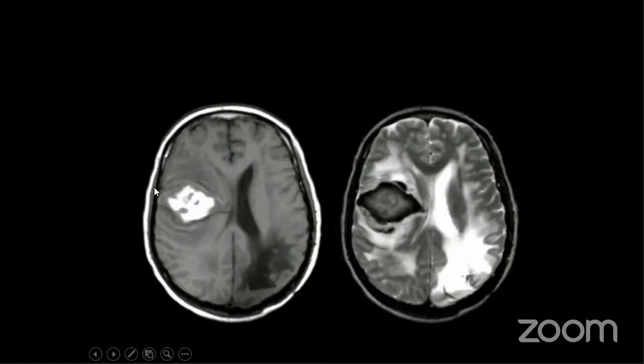Okay, now again, how do you differentiate this from your FLAIR sequence? Now, imagine only this is given. Now you have to say if this is FLAIR or T1. See that gray and white. Gray is gray, white matter is white on T1 weighted. So it is really bright. So you have your hemorrhage here, subacute hemorrhage here. Then all this edema, as I said, edema will be dark, inflammation will all be dark. This is important, right?